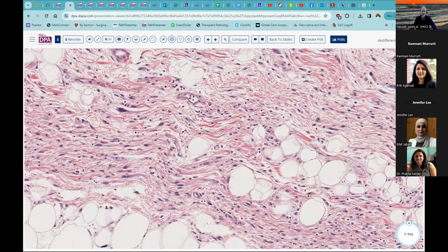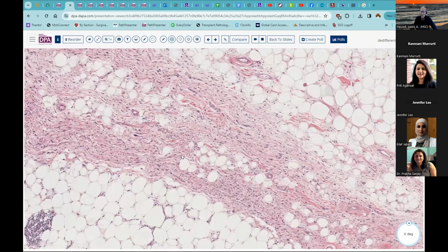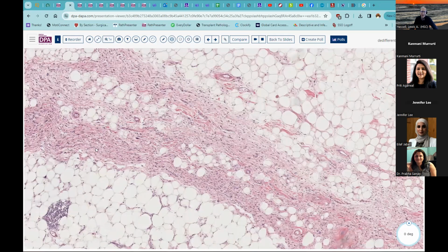not so much as a pure lipogenic tumor as much as a mesenchymal high-grade neoplasm that occurs in specific fatty locations and arises from some of the mesenchymal cells associated with that fatty tissue. Now that may be heretical.